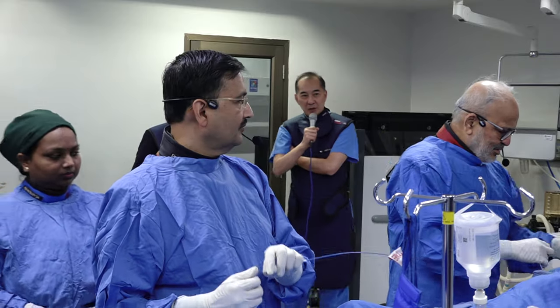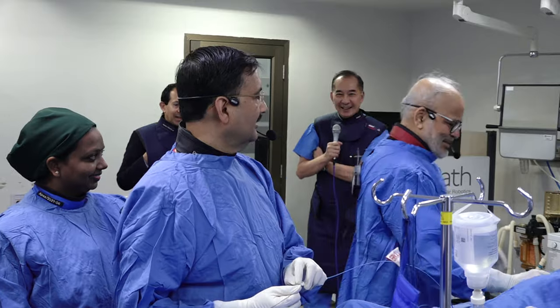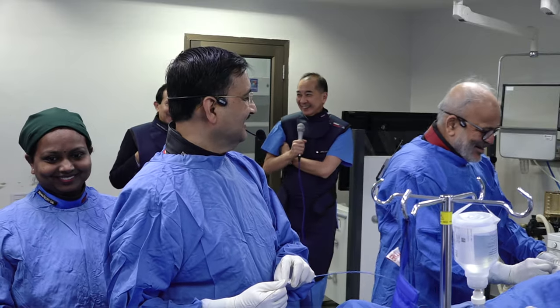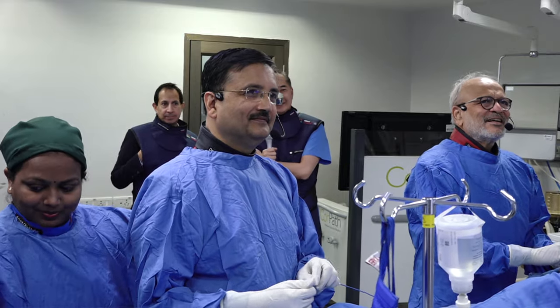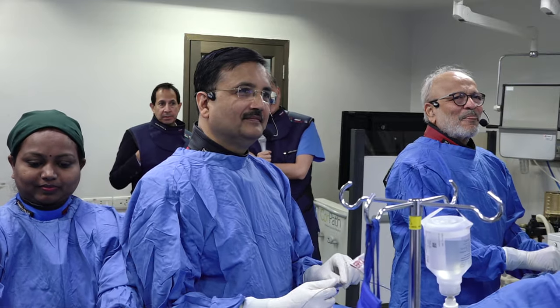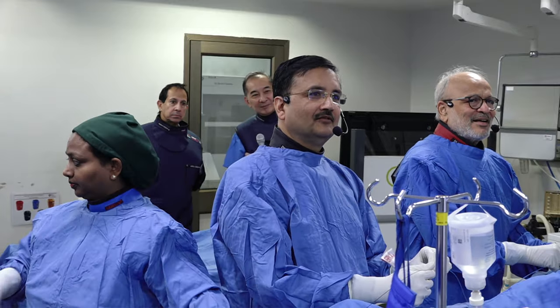Okay. All right, so what guiding catheter did they use? EBU. That was there in my mind, and even in Sanjay's mind. And Tejas, based on the direction of the catheter, it looks as though you had no difficulty coming across from the right radial. Yeah. This is the descending aorta.